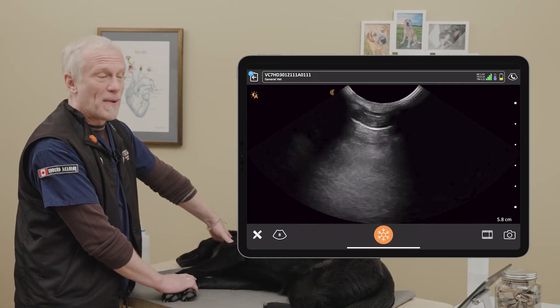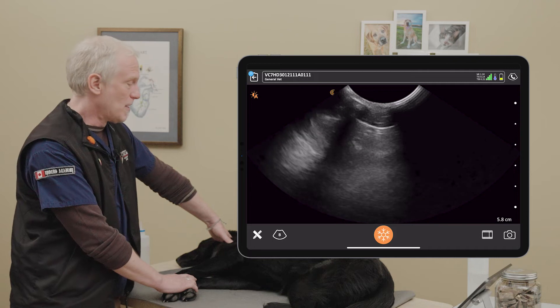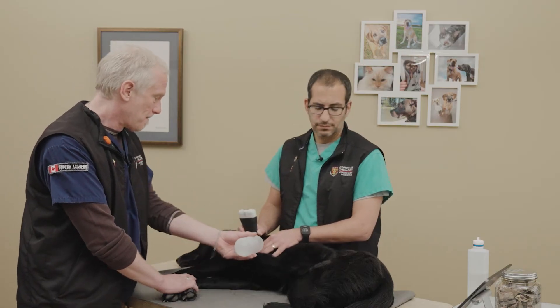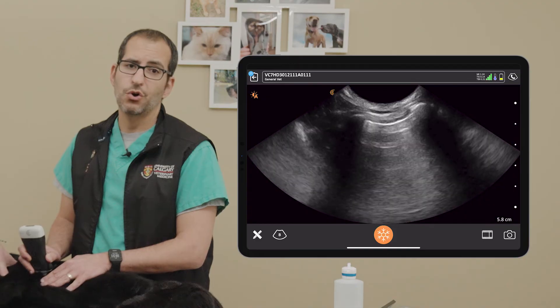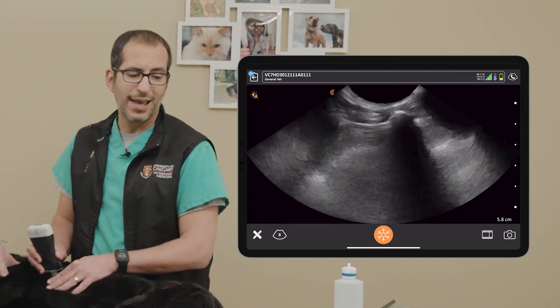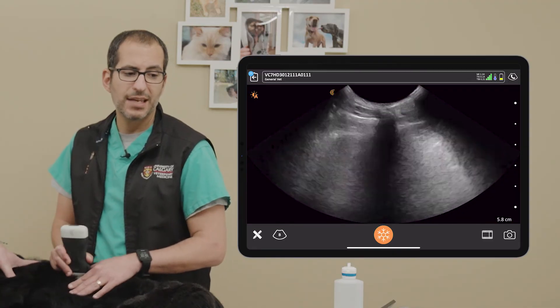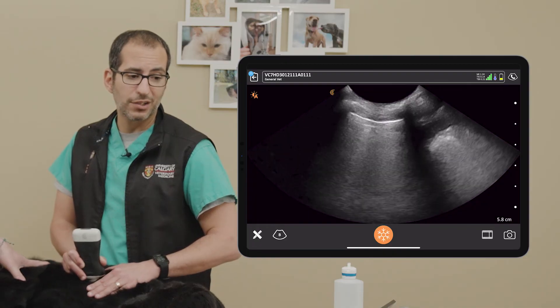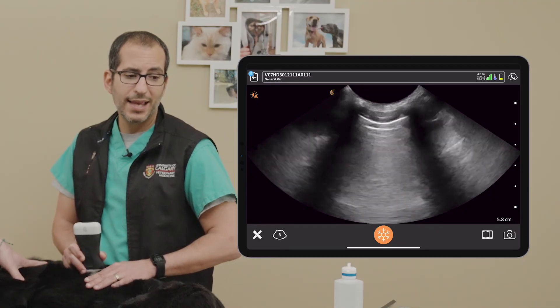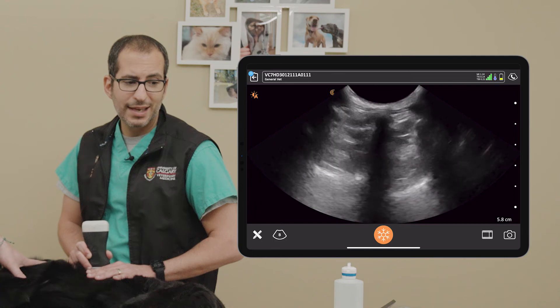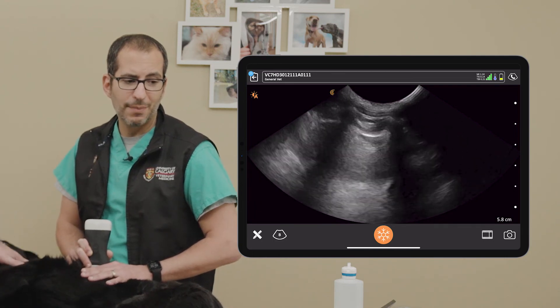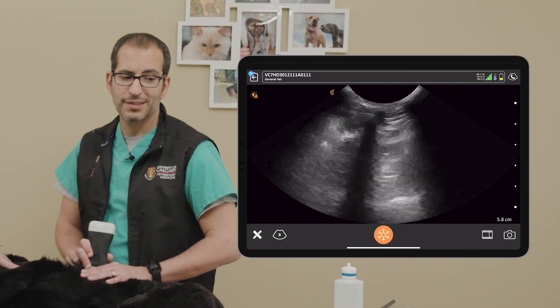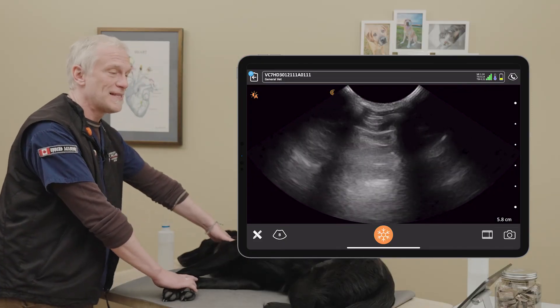We can also often look for abnormalities on that curtain sign as we slide up along the caudal border. Now let me do that again quickly in real time. I'm at the cranial border — I'm sure I'm over lung — and I'll slide the skin backwards. I already asked myself: do I have a glide sign? Because with a massive pneumothorax, you might not have a glide sign where you first place your probe. We did have one here. Now at the caudal border — went from cranial to caudal — I'll go all the way upward until I lose that glide. It's gone. Coming back down, and there's the pleural line. I see a glide sign, which means I do not have a pneumothorax in this hemithorax. That is how we quickly rule out pneumothorax in a sternal or standing patient.